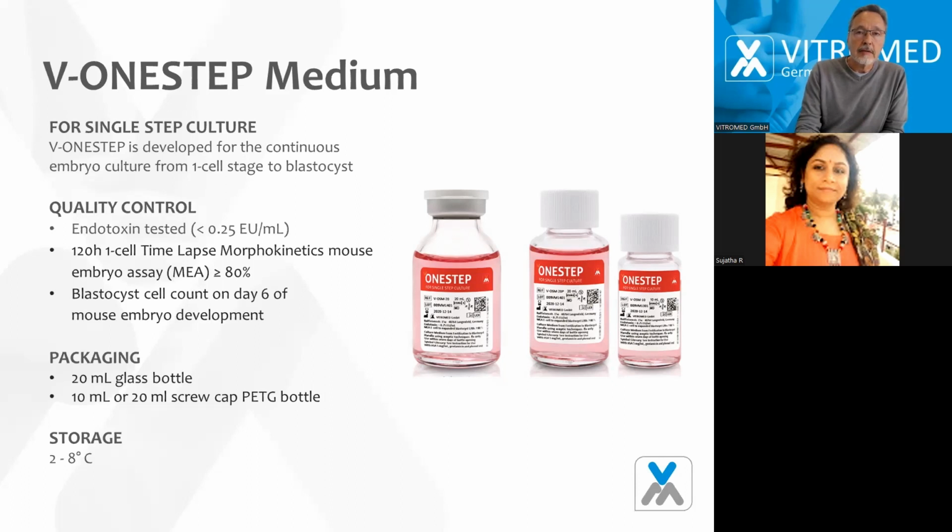A second test that also is not done by most companies, but we do that, is the blastocyst cell count on day 6 of mouse embryo development. It means at the end of the culture, the blastocysts were checked regarding their cell number and are compared to a control group. And if there are big deviations, you can see that the medium is not good enough to use it for human embryos.